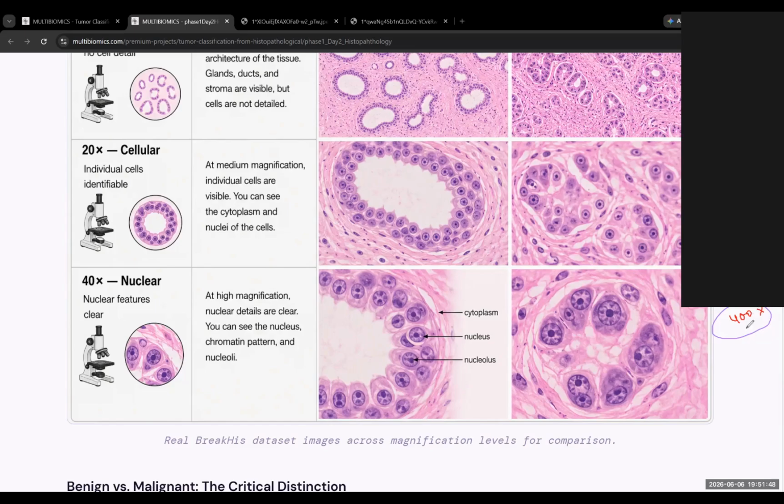The reason we found, through literature search and our own intuition, is that the deeper we go into the cellular structure, it only gets one detail, like the pattern of the nucleus and the shape of the cell.